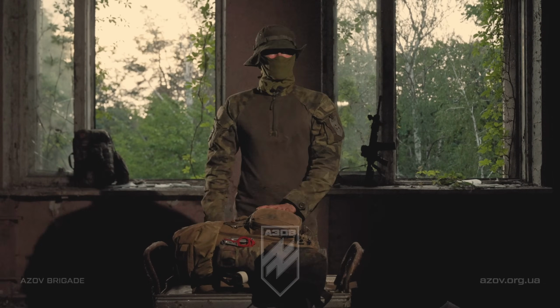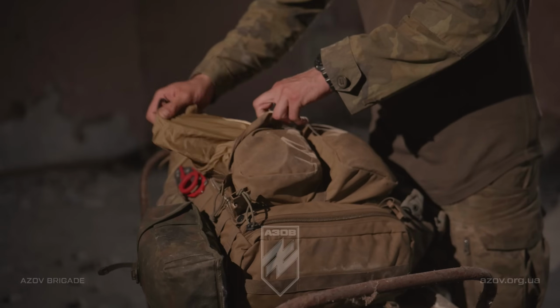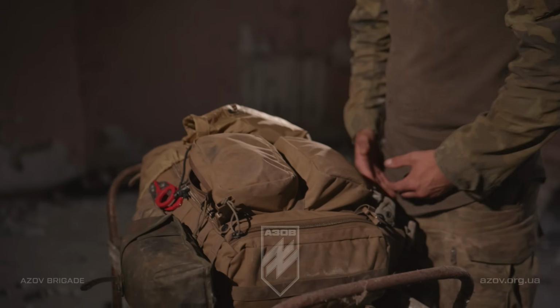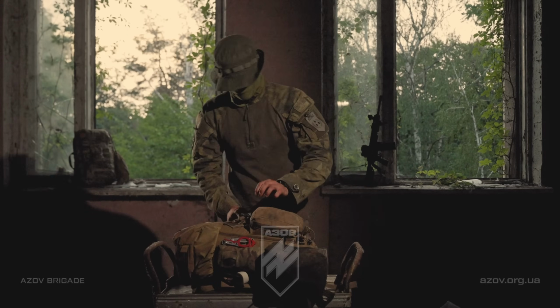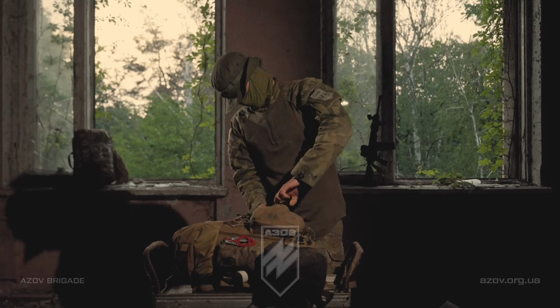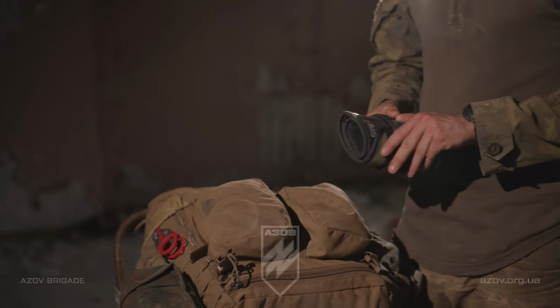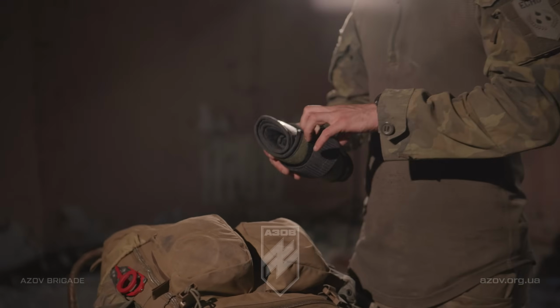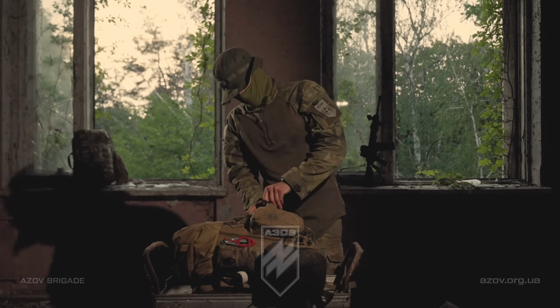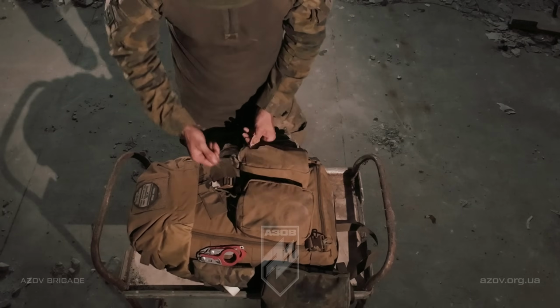Going to the front 2 pouches on this part, in this pocket I have my SAM junctional tourniquet. That's used for down here. Over in here, you're going to see that I have a pelvic binder. Pelvic sling to be exact. This is what we normally use if someone has a suspected pelvic fracture or they've been too close to an explosion. We're going to stabilise their hips. Without going into too much detail, it's a very important piece of kit, especially when you're moving a casualty.